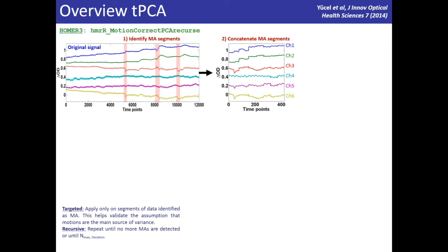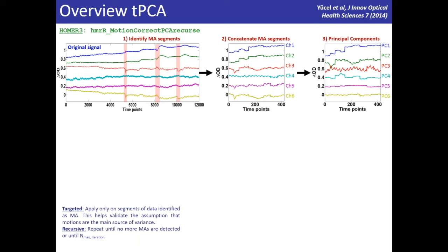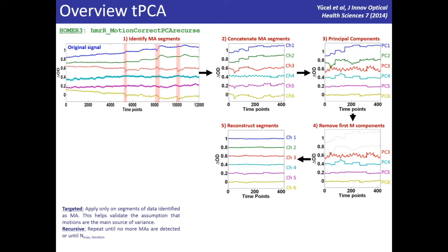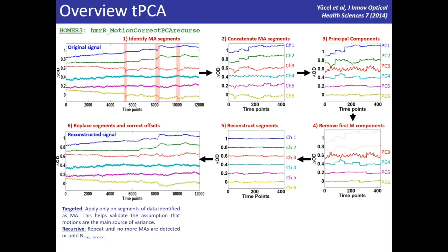So we detect motion contaminated parts of the signal, there again, the red patches here, and then concatenate them and apply PCA, and only on this part of the data set, not the whole data set. And then we can remove either m number of principal components or a percentage of variance from this part of the signal, and then we put the signal back into the original data. And this may also create offsets, and we correct for them. And now our data looks better.